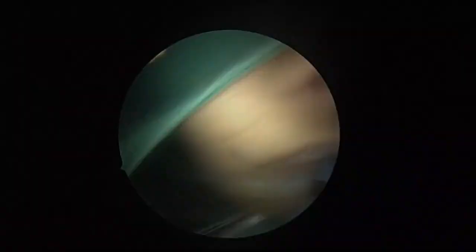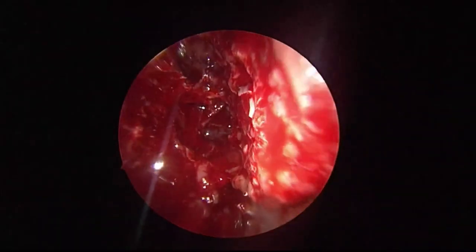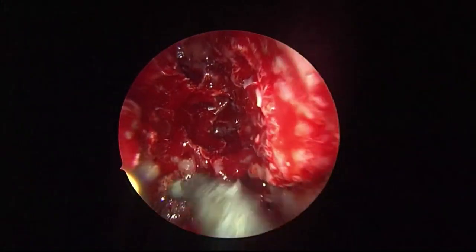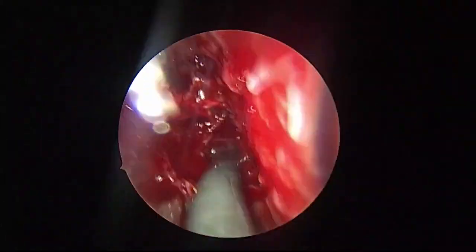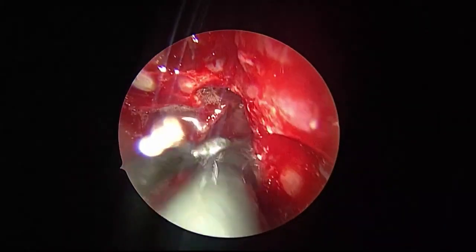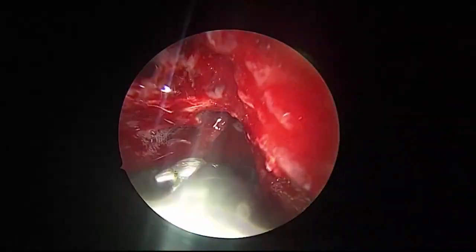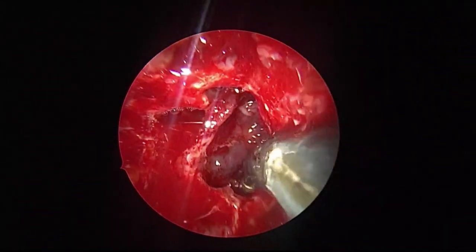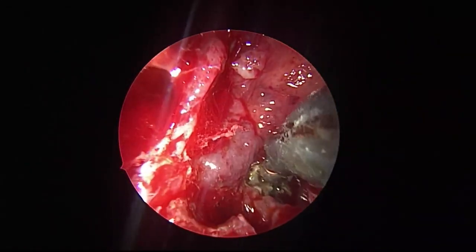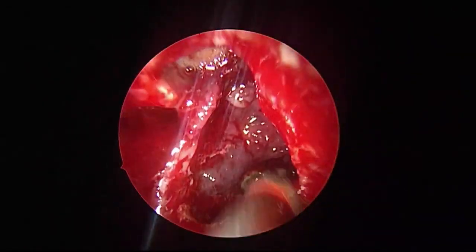See how nicely the high power suction picks up. Flush for any debris, any remnants. See, a big chunk in the clival recess left.